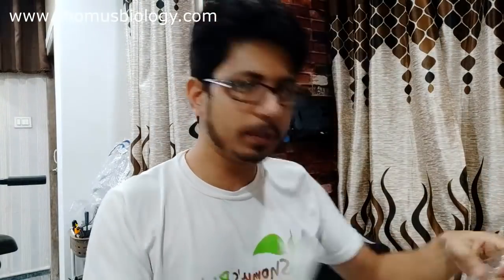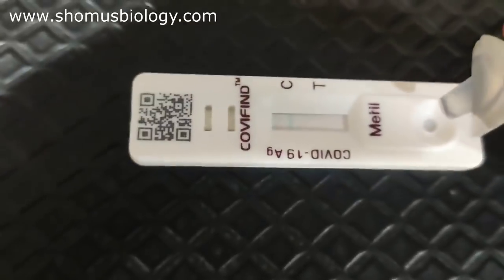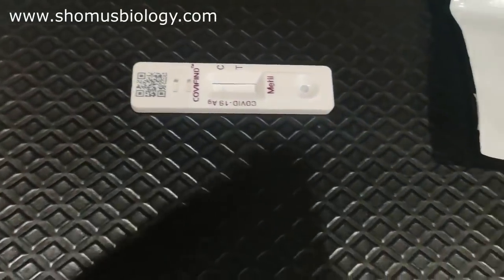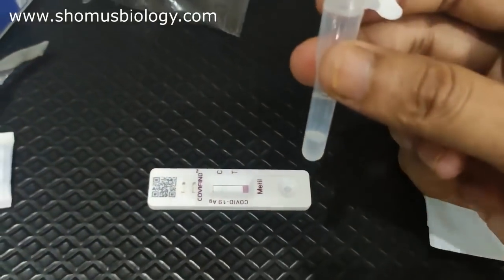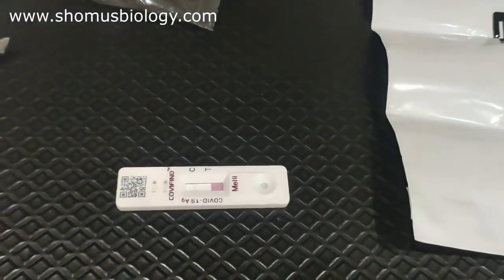Now we're going to put two drops into the cassette. Open the cassette — you can simply tear the packaging by hand. Add two drops of the buffer-swab mixture to the sample well — drop one, drop two. One difference I noticed compared to Coviself is that Covifind provides more buffer solution, so even if you waste one or two drops you can still use it.